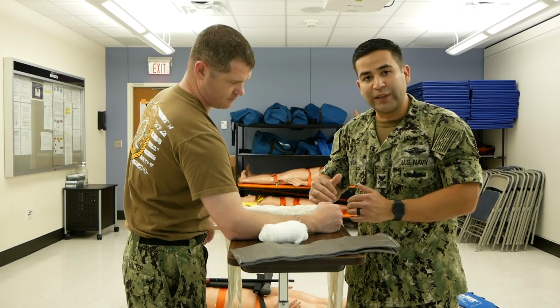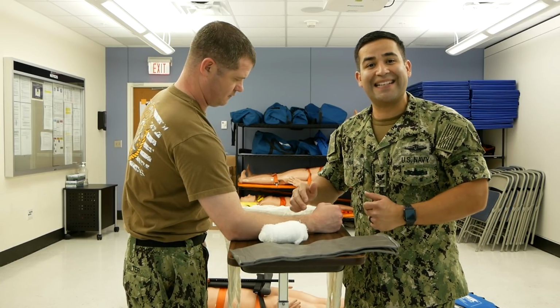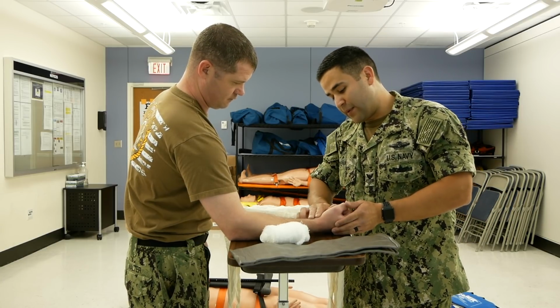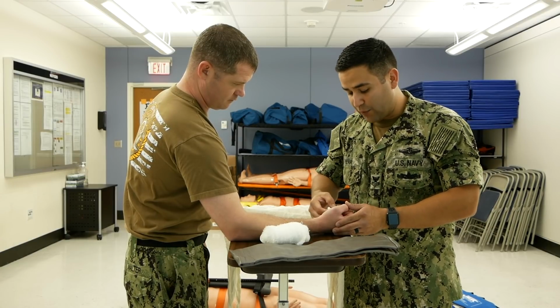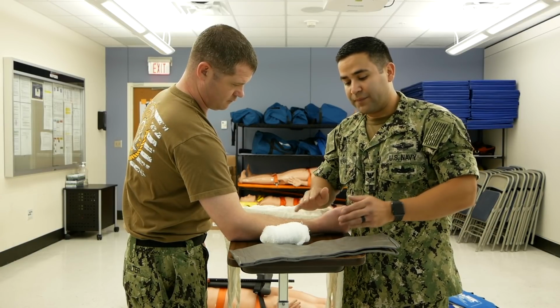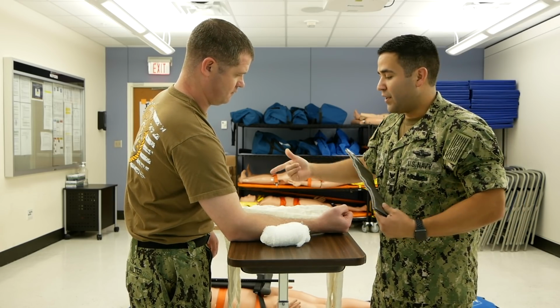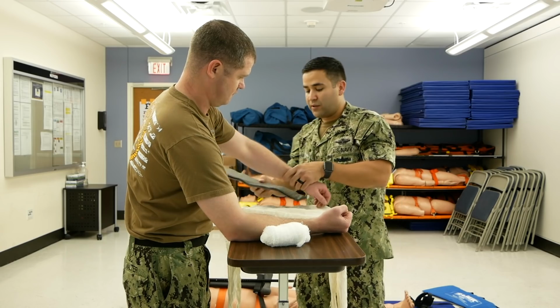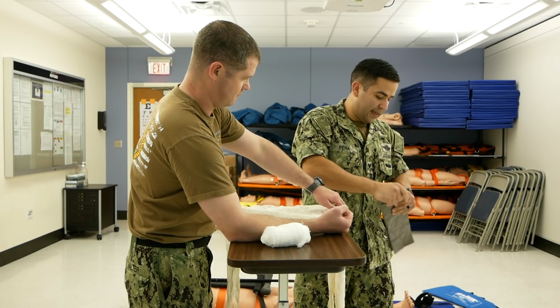Take off any jewelry, any rings that could cut off circulation. While you're doing that, you want to assess CMS. Also check distal pulses and check cap refill. Now I want to go ahead and measure my SAM splint on the unaffected arm. And then make your mold for a wrist fracture.